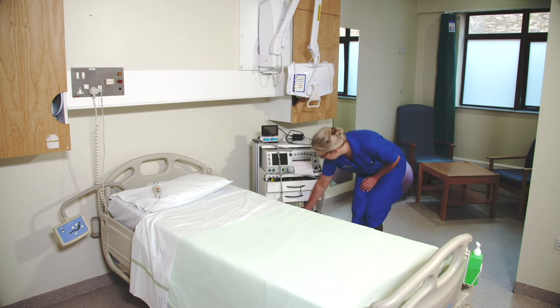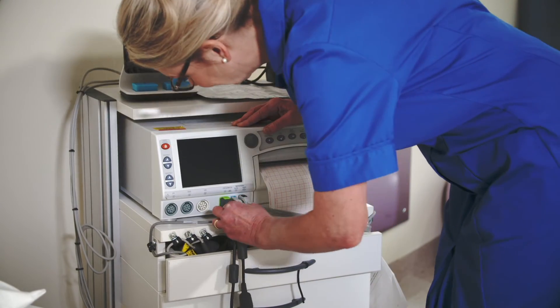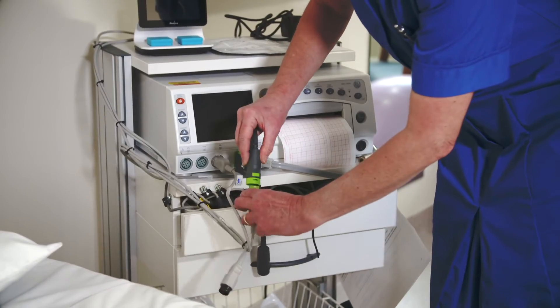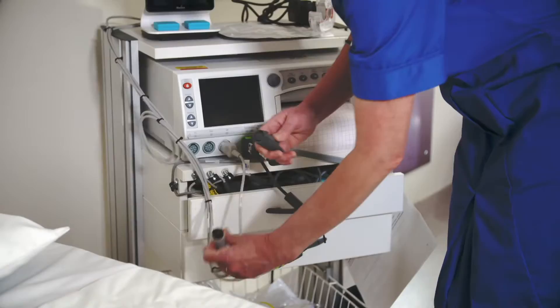Connect the Y adapter into the monitor. The three interface cables have color-coded plugs. The white plug connects to the TOCO input. The green and gray plugs connect to the maternal ECG and fetal ECG inputs on the Y adapter.